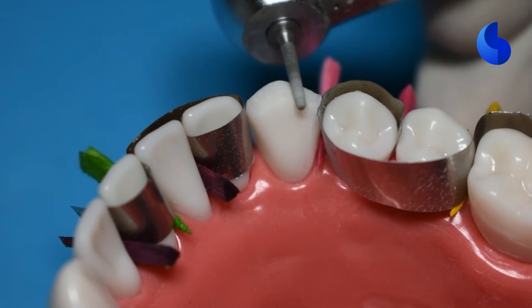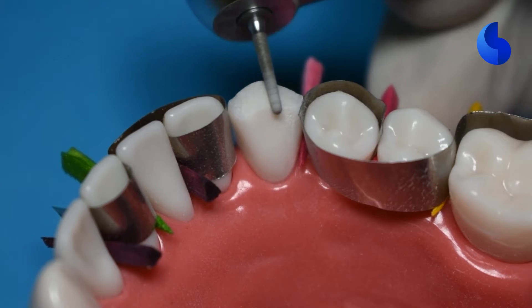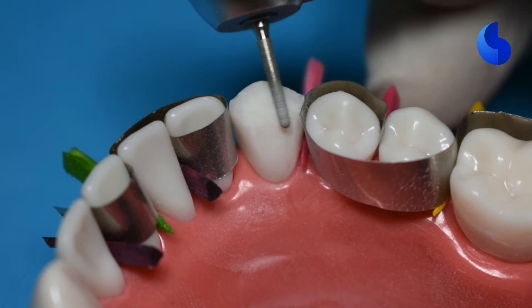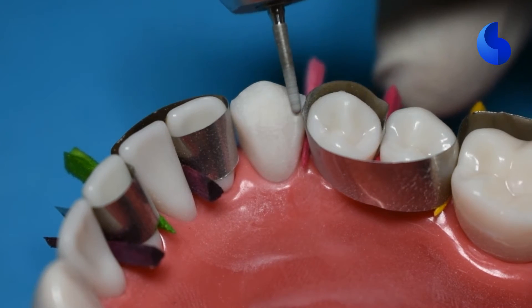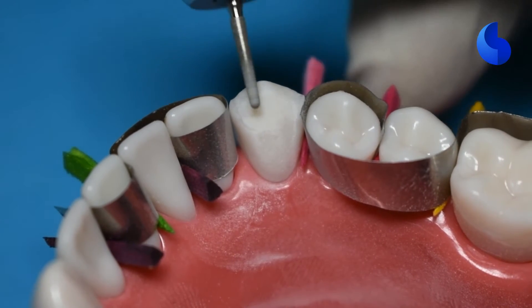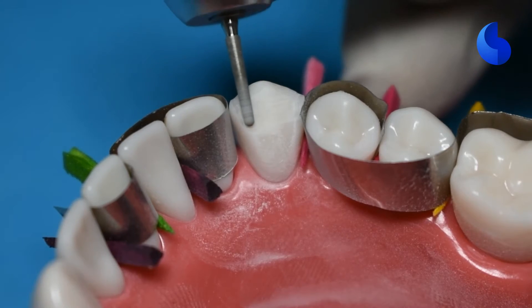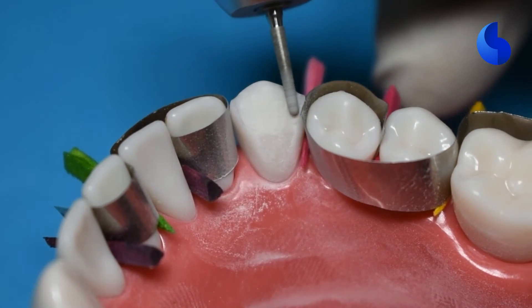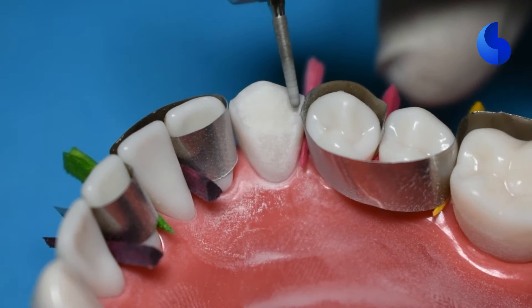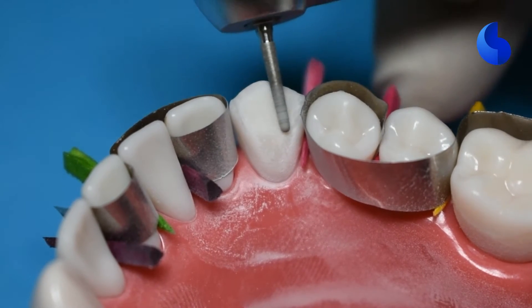Once you've verified that you have sufficient incisal reduction, go on to the lingual and place a bevel that is perpendicular to your opposing tooth structure. This is to give enough bulk to the surface coming in contact with the opposing tooth so that the porcelain has sufficient bulk to withstand the forces placed on this incisal-lingual portion. The best way is to follow the long axis of the tooth and continue to reduce going further down. This is not your entire lingual reduction, but gives you a start with sufficient bulk that you'll increase during full lingual reduction.